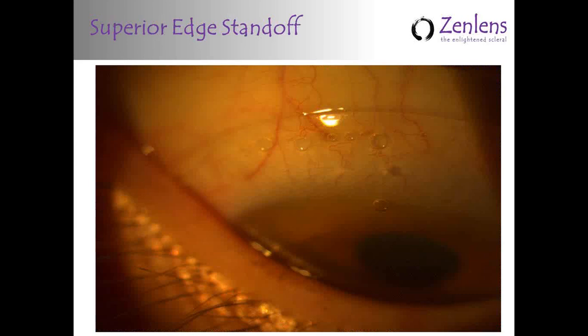Here's an example of one that's a little more obvious. This would be the type of thing you can see with white light. This is actually a bubble, a series of bubbles. If we had it in video, you'd actually see these bubbles moving underneath the edge of the lens and into the corneal chamber, where they would coalesce into a larger air bubble. So this is a rather obvious example where the edge is lifting off too far from the scleral, the conjunctival surface, and it's allowing air to get through. So you would need to steepen this.